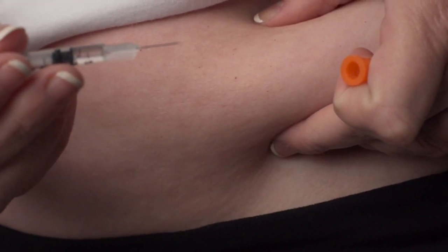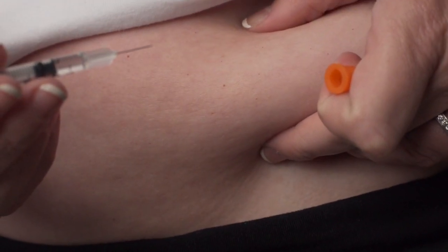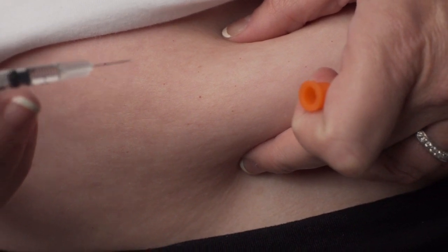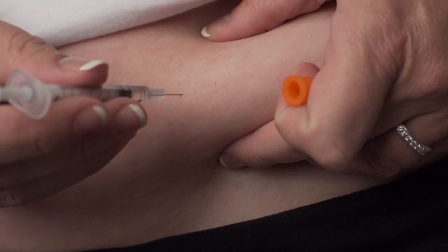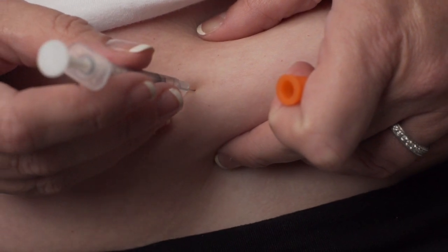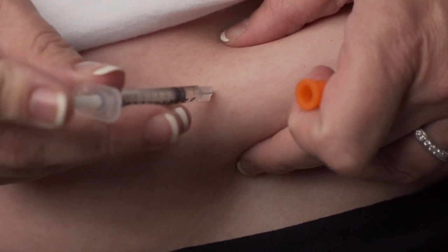Hold the syringe in your dominant hand like a pen or pencil. With the other hand, gently grasp a small fold of skin between your thumb and index finger at the selected injection site. Insert the entire length of the needle into the fold of skin at a 45 to 90 degree angle.